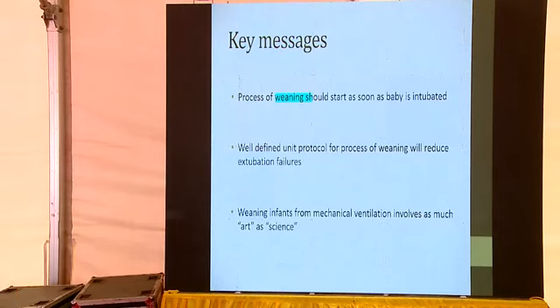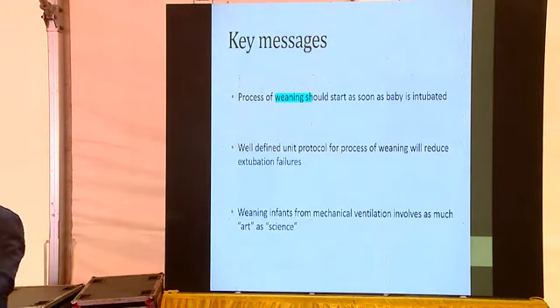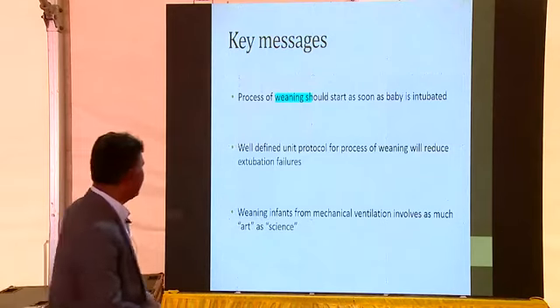Handle it well, your life will be much better than saying no, no, I will get a new one, because again you are going to have some new problems. So if you buy new ventilators, you are going to have new problems. Stay with your old ventilators, you are much better off. Right, cool. So I'm coming to the key messages.